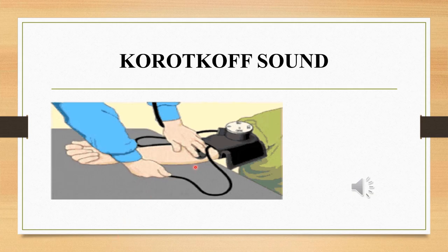In this picture, you can clearly see how to attach the cuff, where to keep the stethoscope, and how to inflate the cuff, and simultaneously you have to note the readings in the manometer.